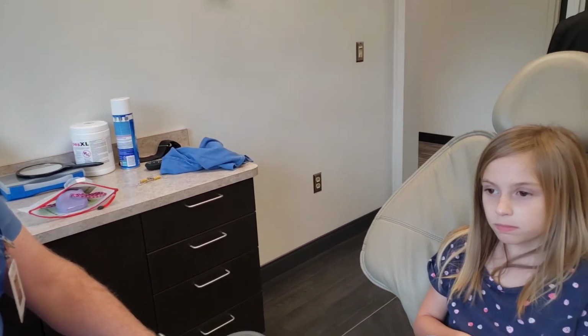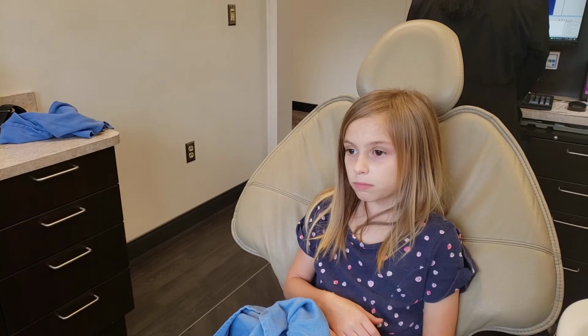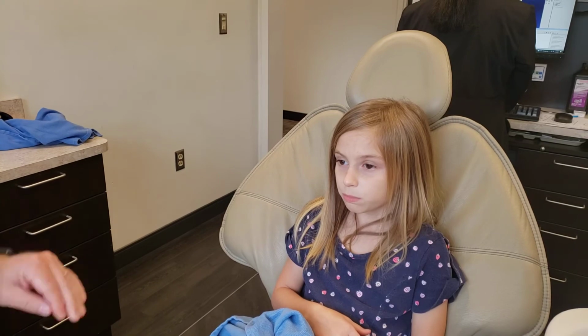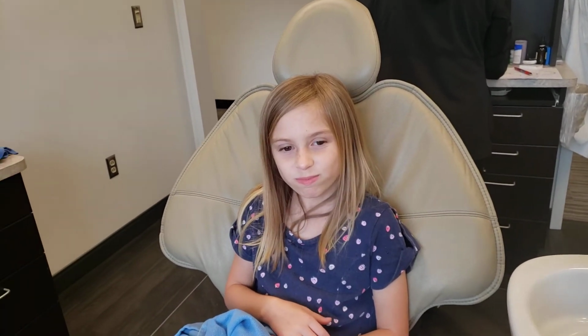So she's going to be wearing this the same, which is 2 hours a day passively. I recommend breaking it up into 1 hour sessions. And anytime it's in their mouth, lips are together. See how she has nice relaxed cheeks. She's having to force her bottom lip together. That's fine. It is kind of bulky, but she's able to swallow without having to use too much of her facial muscles. Great job. It's a mouthful.